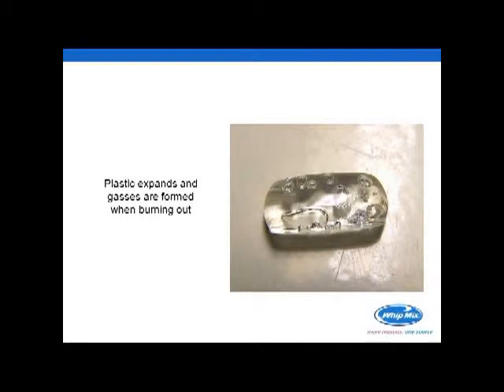The greatest thing that you can do is to increase the distance between your patterns and not place so many in your ring. That will increase the thickness of the investment and give it a little more added strength. You can't coat those things with wax to get away with it, nor can you coat plastic implant parts. They're going to be problematic. So since they do have small or fine features to them, especially UCLAs, where you need to run investment through a center hole, that becomes much like, for those of you who have basements, much like that little tiny pole that's standing there in the middle of your basement in a gigantic room.